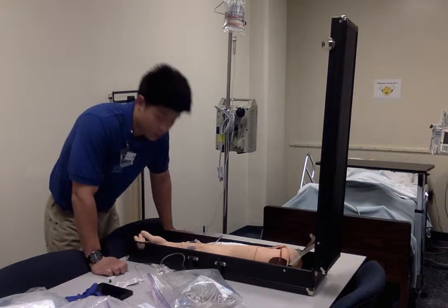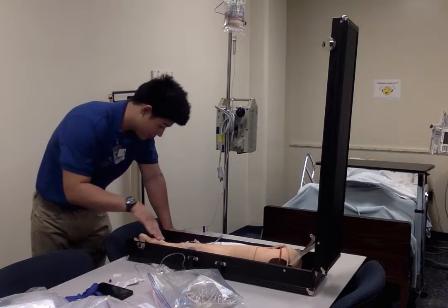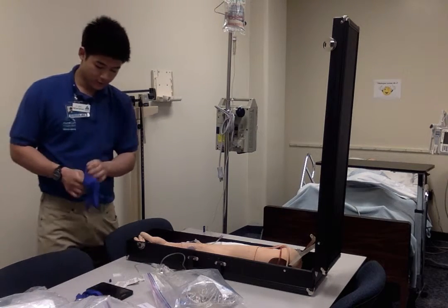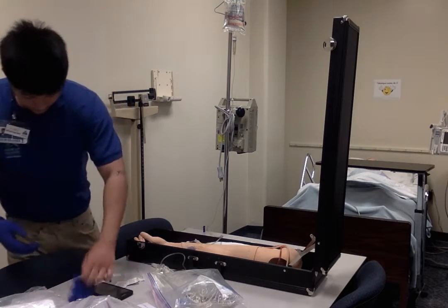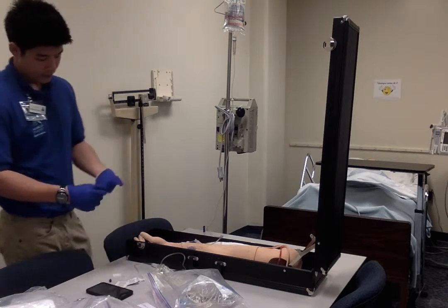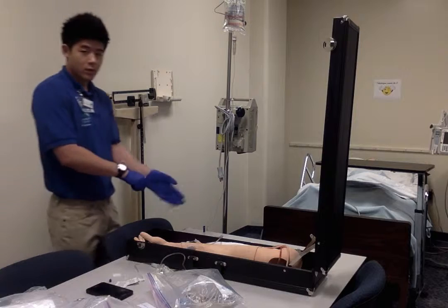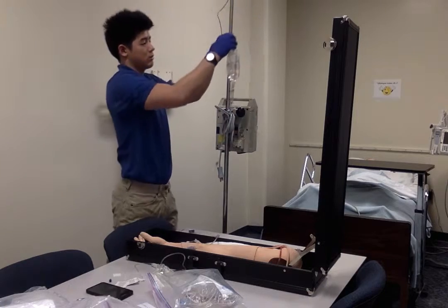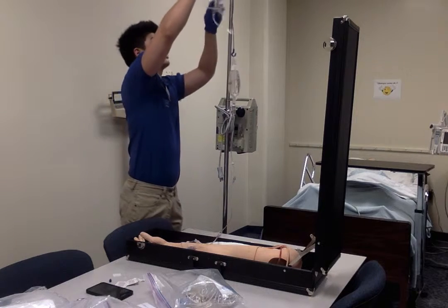So looking at the arm, I'm going to look for phlebitis or any infiltration, any tenderness or redness. I don't see it. So now I'm going to do my hand hygiene and apply my gloves. All right, first things first. We'll go ahead and lower this medication.